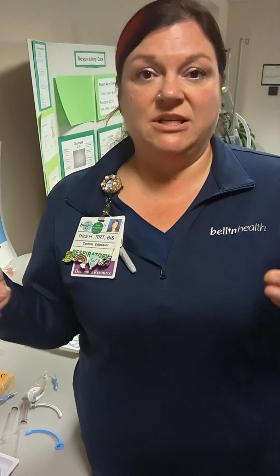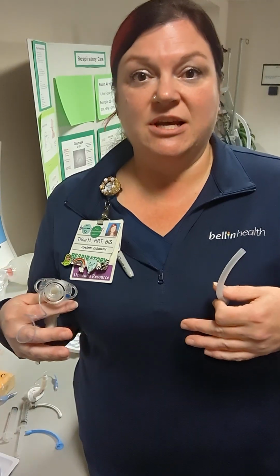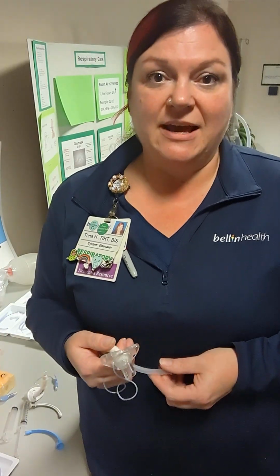Okay, so we take these out. Trach cares are typically every 8 hours or so, certainly once a shift. And cooperatively between RT and nursing staff, we'd like to move to doing those cares either together or at least communicating when they need to be done, who will be doing them, and how we go about doing that.